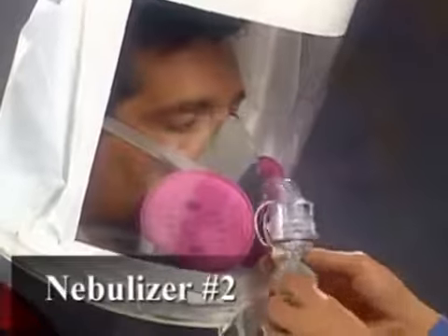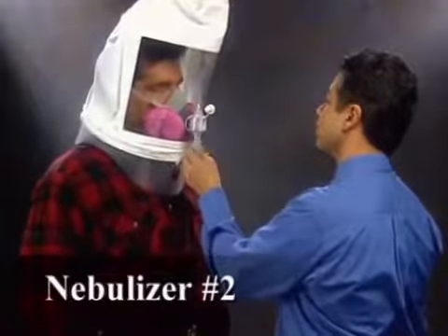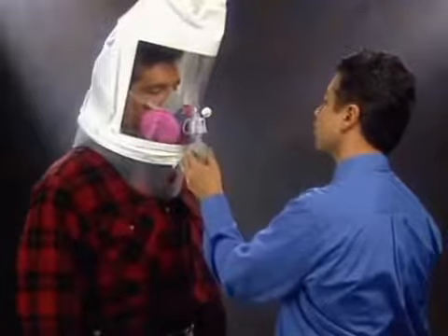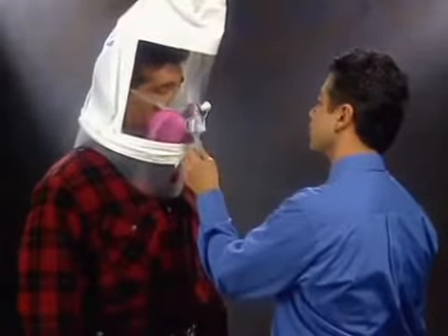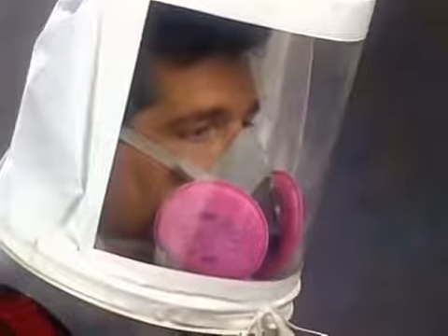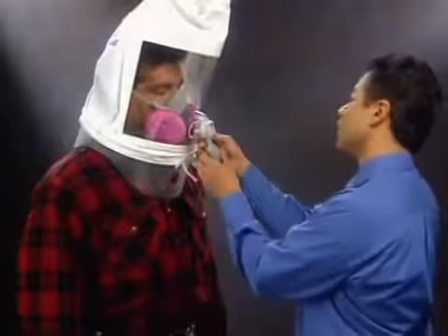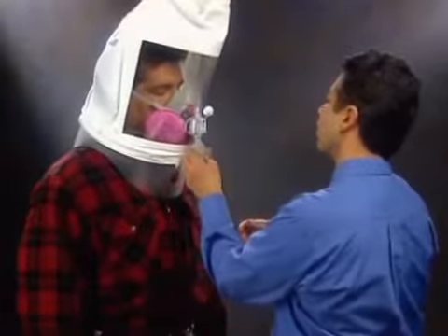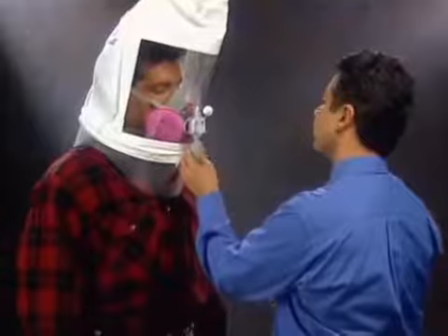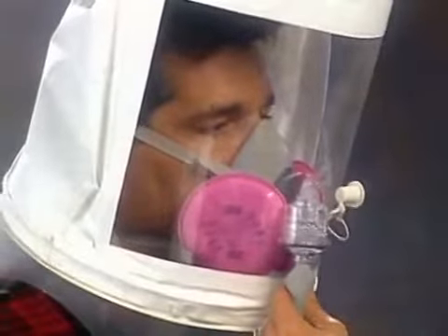Now using nebulizer number 2, the instructor will spray the fit test agent into the hood using 10, 20, or 30 squeezes, depending on the number of squeezes needed to taste the test agent. To maintain the concentration of solution during the test, the instructor will inject one half the number of squeezes used at the beginning of the fit test — 5, 10, or 15 — every 30 seconds thereafter.